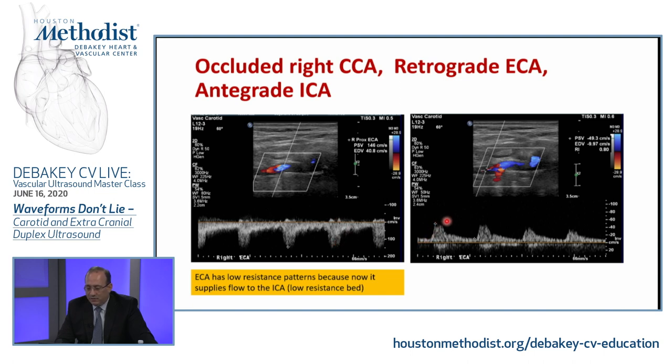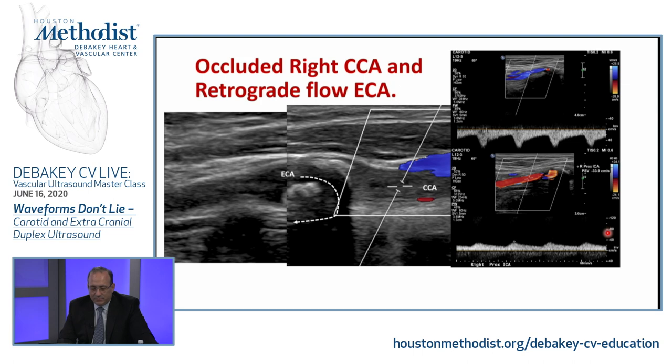And now you have this kind of nice, normal looking internal carotid waveform that's kind of being fed from the external carotid as we had discussed. Again, here are some more examples. Again, low resistance external carotid. Reverse flow. Why? Because it's flowing into the low resistance internal carotid.